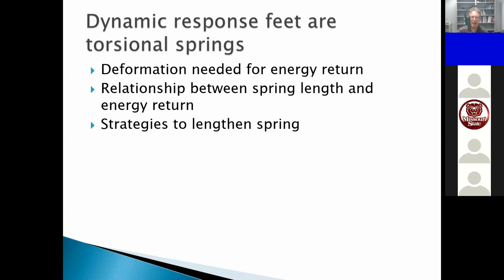But what happens, and this is very strong, so I'm not going to be able to bend it very much, but what happens with heel contact is that the heel part of this blade will bend and then spring back. And then what happens actually, and this is even more important, with terminal stance, is that the toe part of this blade will bend into dorsiflexion and then spring back. And the more bend you have, the more potential energy return you get. So it's like a biological system. This is how our feet and ankles work also.